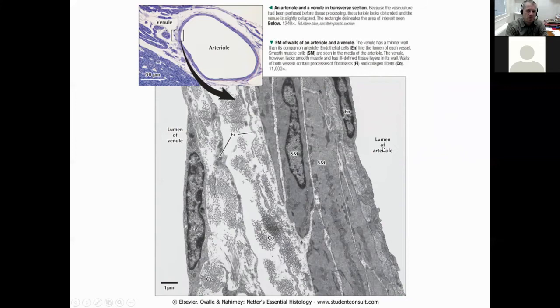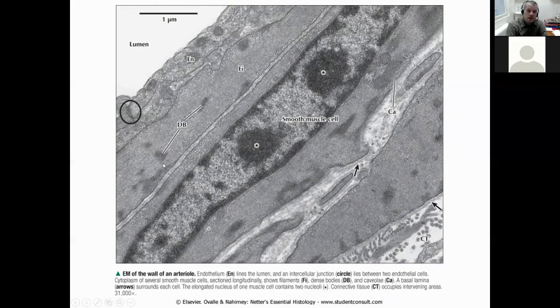Again, this is to show the interior of an endothelial cell with some vesicles. I hope you can see this. There's a vesicle forming right now, and this points to one of the functions of the endothelium, this is to transport vesicles from the blood to the deeper aspects of the vascular wall. We call it transcytosis. And so there is a formation of vesicles that are transported across the endothelium and released on the other side.